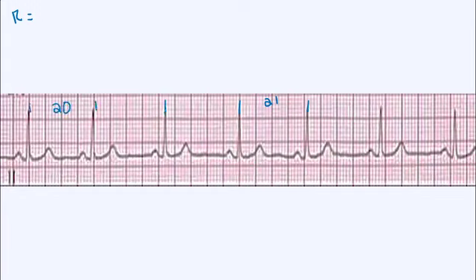And then from this R wave to this R wave, we have about 23 small boxes. So for the most part, they are within one to two small boxes, and that is enough to call it a regular rhythm.